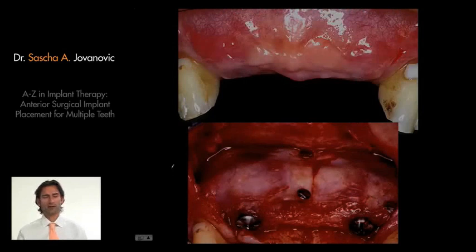Now you can see the ridge recreated here at the top photo. And you can see how the 2 implants in the lateral incisor are submerged and the central incisor area is augmented. In this particular case, because of the bone graft, we waited about 6 months. And at 6 months, we're coming back with an uncovering procedure which will bring keratinized and thick soft tissue to the buccal. And it's going to expose the buccal area where we can either review the bone, the implant, or remove materials like here, membranes and titanium bone tacks.